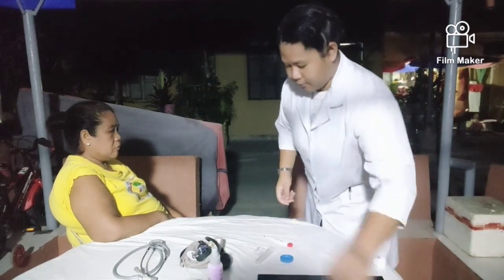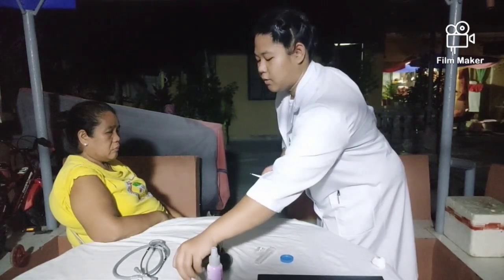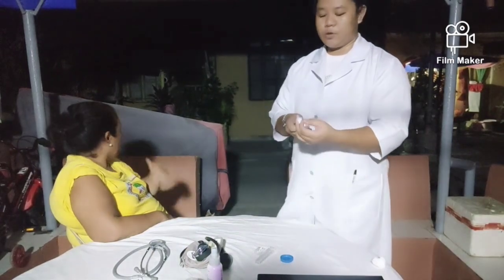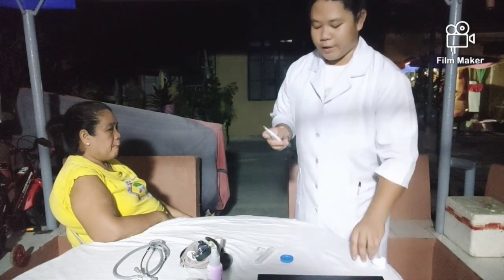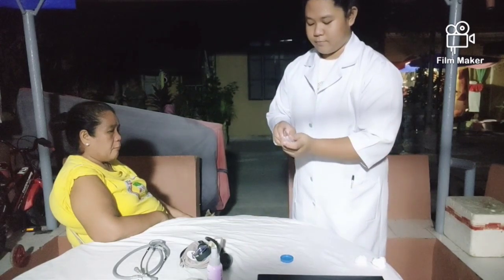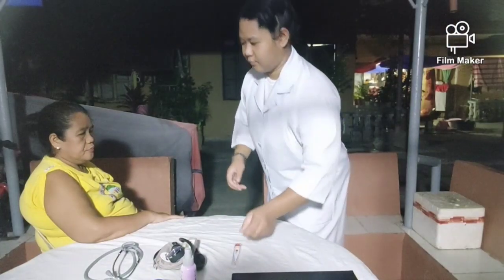After that, get another clean cotton ball, then clean the thermometer from tip to bottom. Then, put the thermometer in its cover.